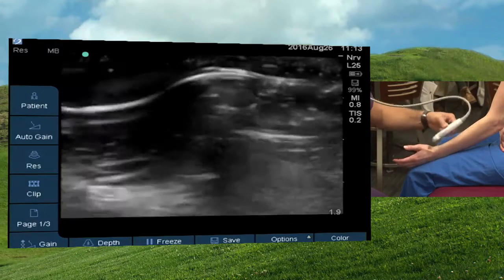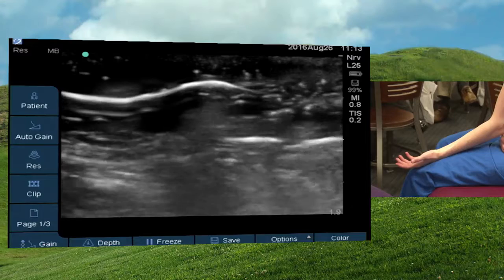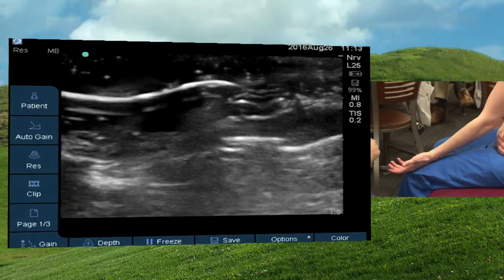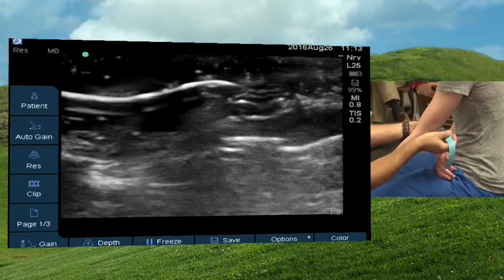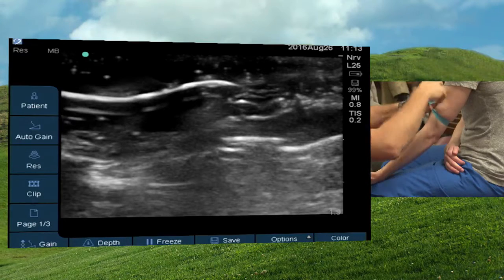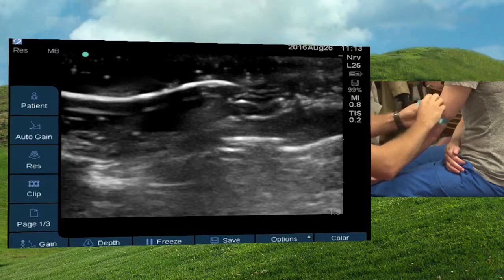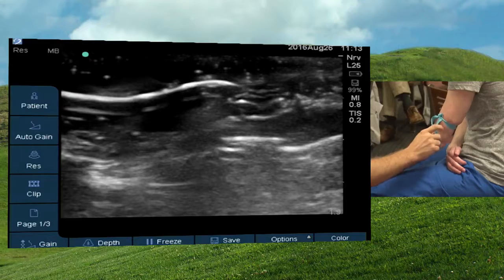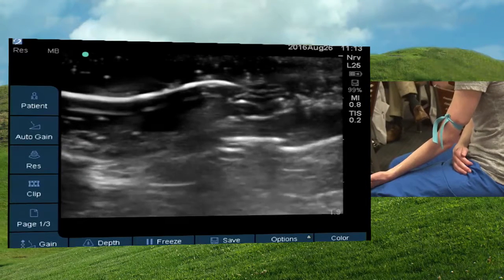So I'm going to go on up the upper extremity here, and if you're not putting arterial lines as a third-year student, and I'm sure some of you are and some of you aren't, something you will get asked to do is to put an IV in a patient who's a difficult IV stick, okay? And when I get called here in Kirksville to put an IV in someone who's a difficult IV stick, which Beth clearly is not, and that's okay, I take my ultrasound with me, okay?